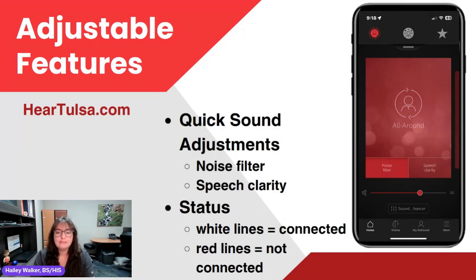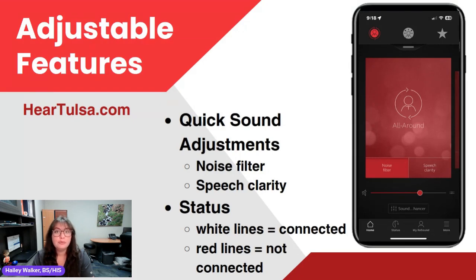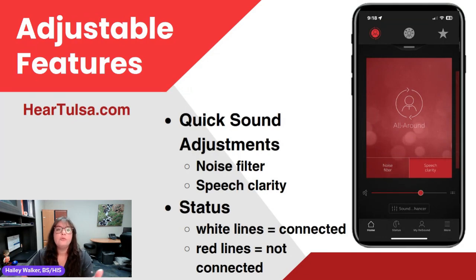Here are those screenshots. We see the all around program. We also have two buttons underneath it — noise filter and speech clarity. These should be on almost all programs except custom programs. When we want the noise filter on, just tap it and it turns into a bright red color. Speech clarity works the same way — tap it and when it's bright red, it's on. To turn it off, tap on that same button. Note that you can't have both noise filter and speech clarity on at the same time.